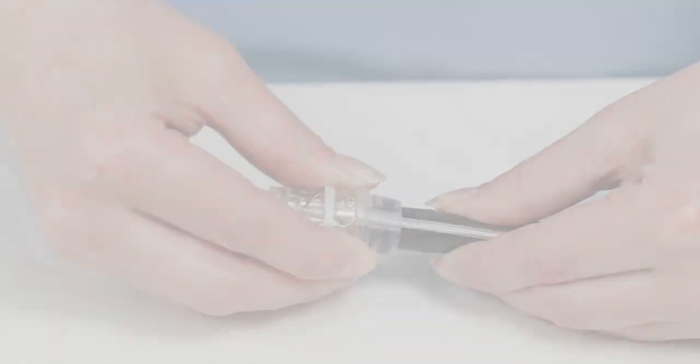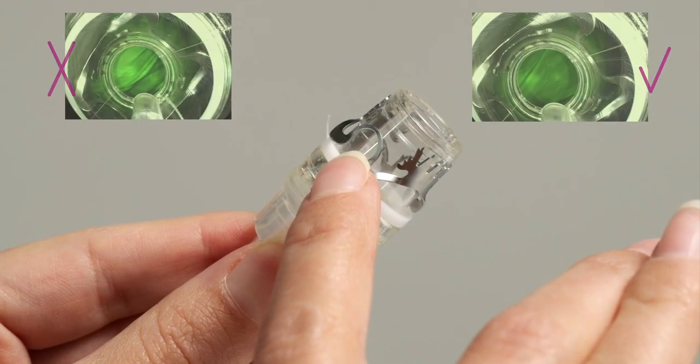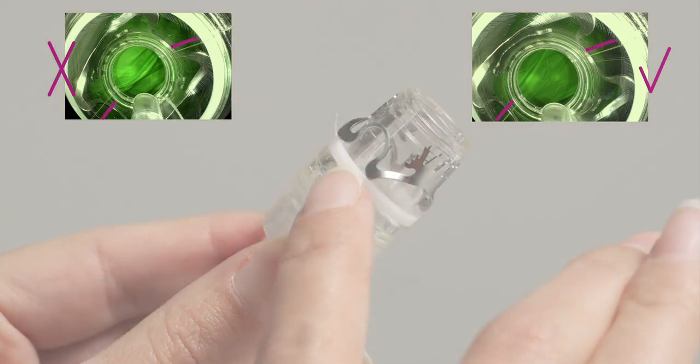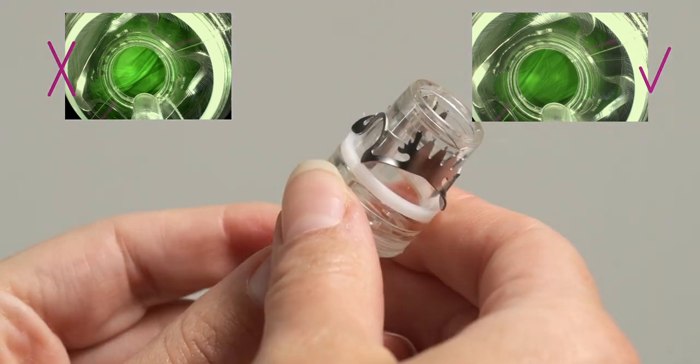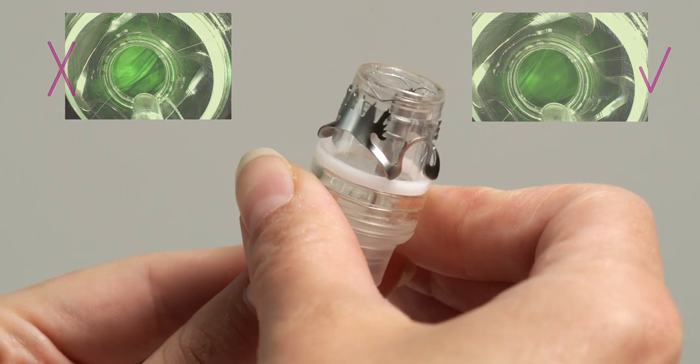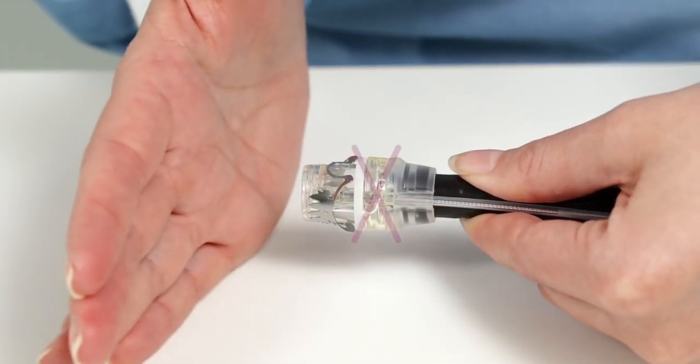During assembly, it must be ensured that the clip remains correctly positioned on the application cap. It must not be twisted or caught by the thread. The cap should not be pressed against the hand or table during assembly, as this could damage the cap.